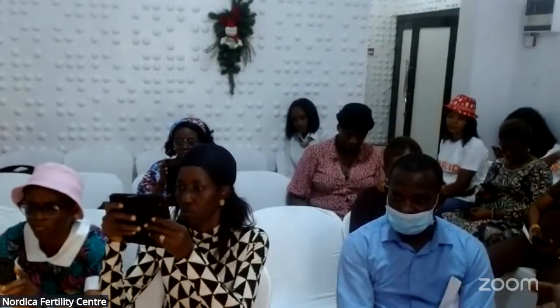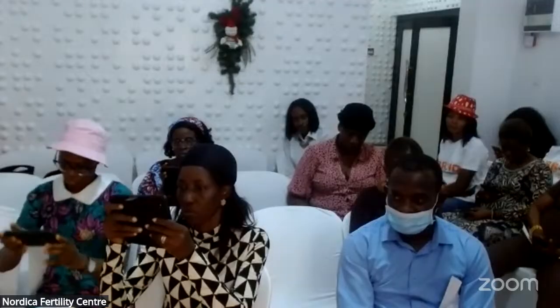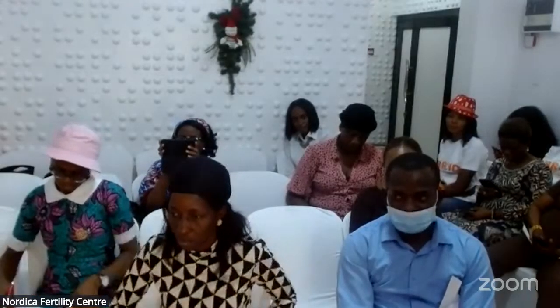Next slide. Now, the main focus, which is HIFU, high intensity focused ultrasound. HIFU is relatively new, about 4 years now in Nigeria, but outside the country it has been there for a decade now. It's a completely non-invasive treatment option for symptomatic uterine fibroid, and it uses ultrasound waves. So it is not laser therapy. It is not radiotherapy at all, because people usually make that error.